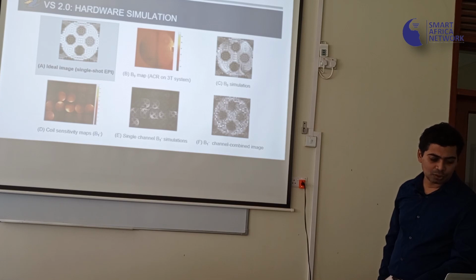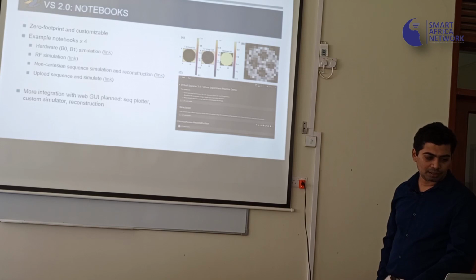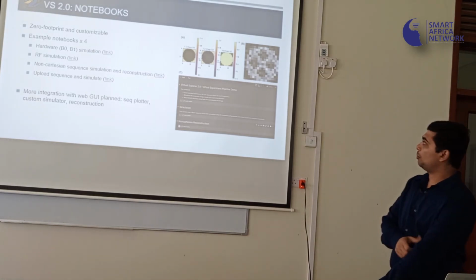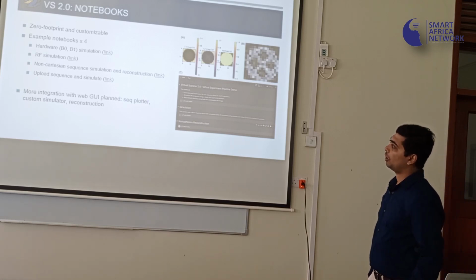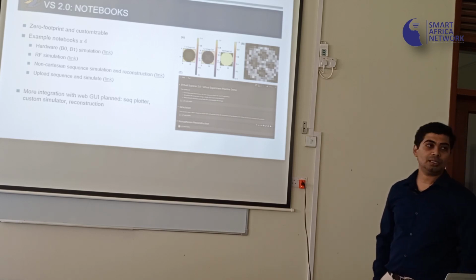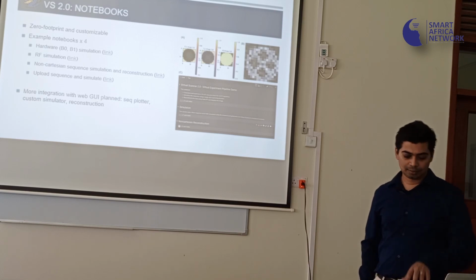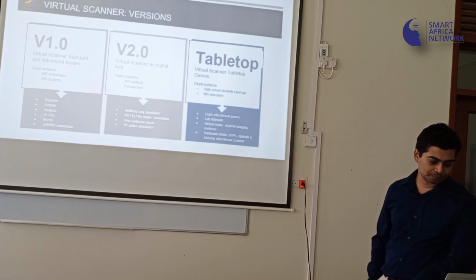I'll skip this slide, but you can do hardware simulations on the transmit and receive side. And we have a bunch of notebooks, like Jupyter notebooks, that you can try out. Depending upon whether you are interested in hardware or RF simulation or acquisition or reconstruction, you can just get started by playing around on any of these Jupyter notebooks, which is again a Google Colab notebook.